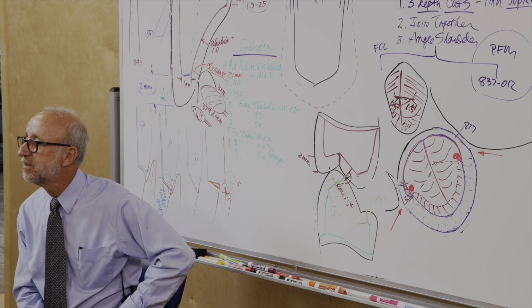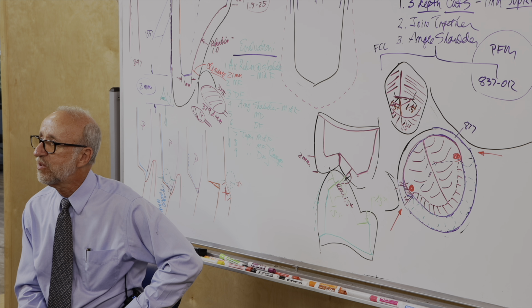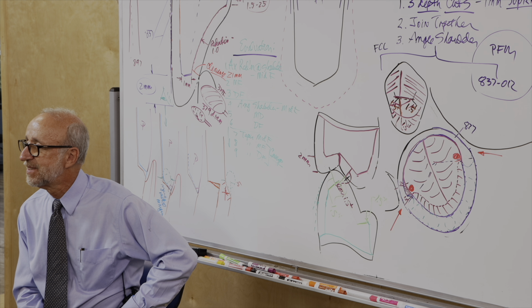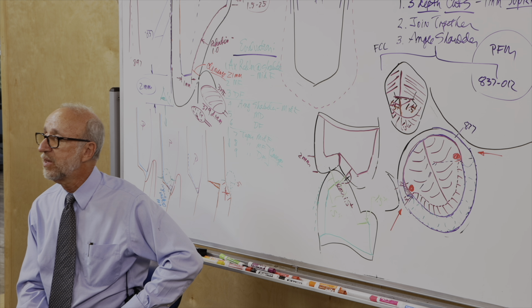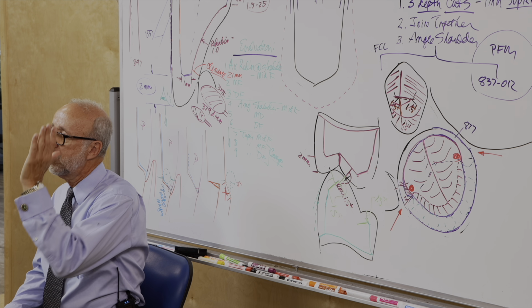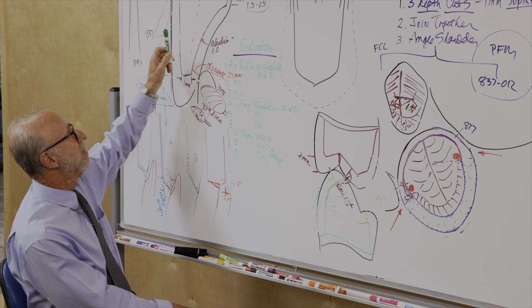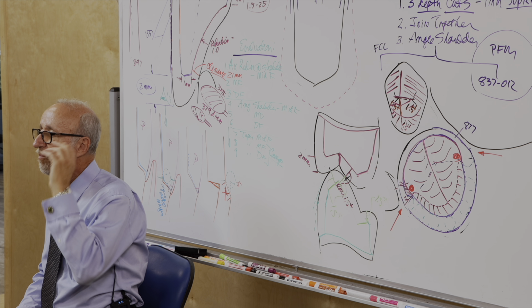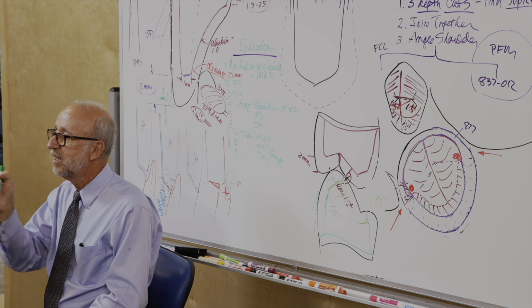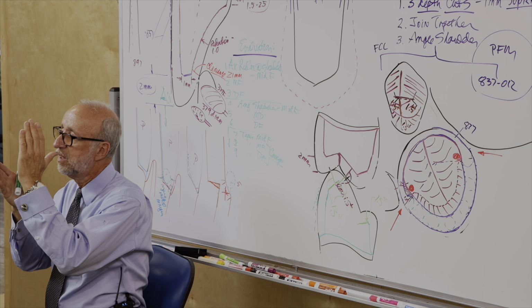Okay, how are we doing? Yep. Just want to make sure the secondary plane is always on the functional cusp, right? From maxillary to lingual, no? Secondary planes are wherever they're needed. Okay? So now on the upper tooth, okay? So the facial cusp has a little bit more vertical here. So for the maxillary molars, we have a fairly rounded surface on the lingual, and it's kind of rounded on the facial side as well.